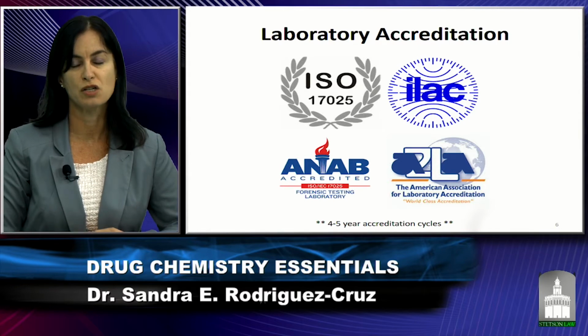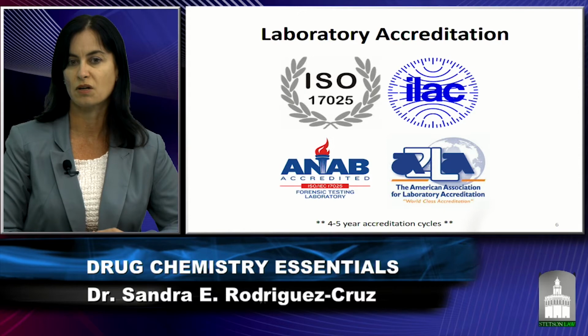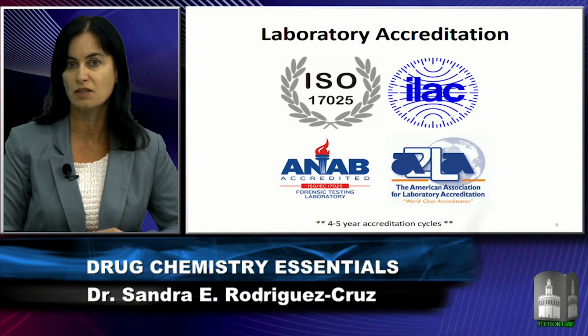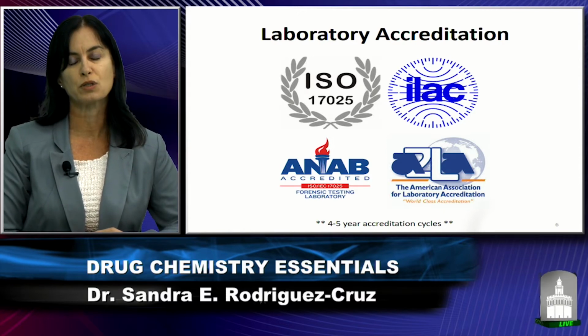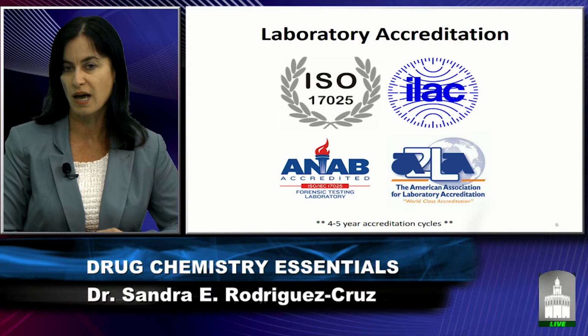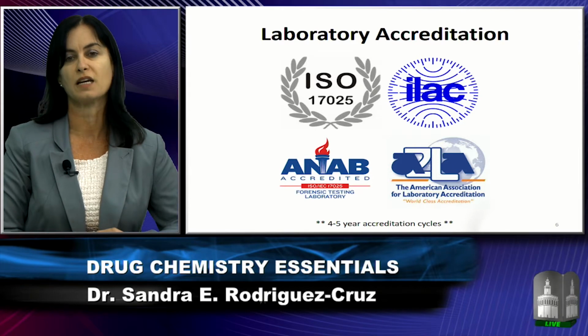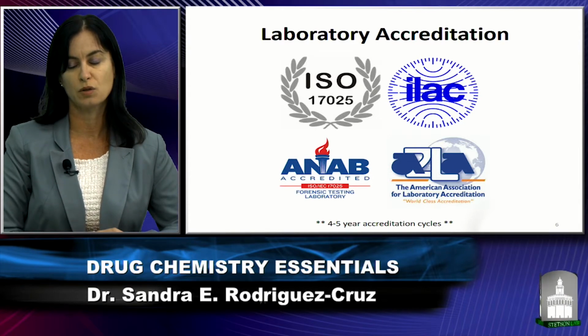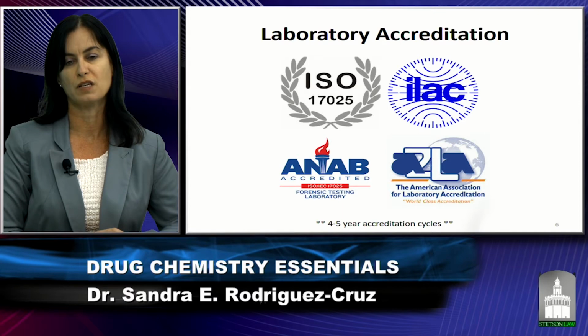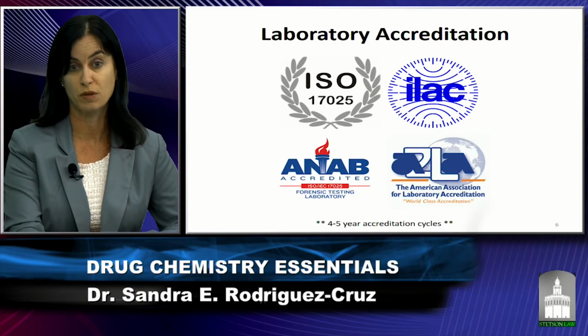Laboratory accreditation is not mandatory throughout the United States. Only few states have made it mandatory. So a lot of the laboratories performing seized drug analysis do undergo voluntary laboratory accreditation. And there's over 300 laboratories throughout the US that have become voluntarily accredited in order to comply with a lot of these requirements and have provided quality assurance program within their laboratories.